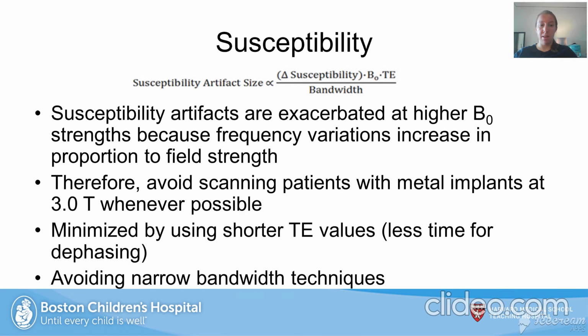So these are some examples of susceptibility artifacts. Here you have a metallic substance in the eye makeup. This is a picture of the brain with the person's nose, and this should be an eye here. There should be some signal here as well. The patient is actually wearing eye makeup, as I mentioned, and it's got some metallic substance in it. Typically what you would do is just tell the patient to go remove the eye makeup, and then you would re-image them, unless you don't care about what's happening in the eye region.